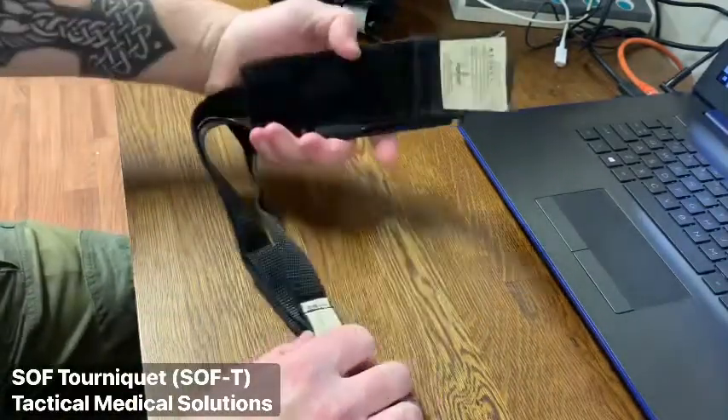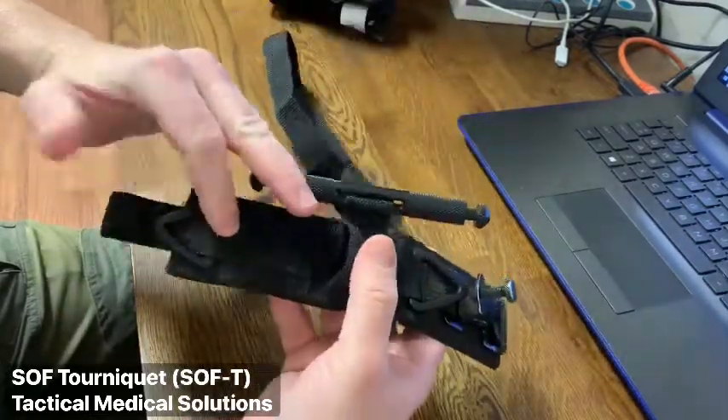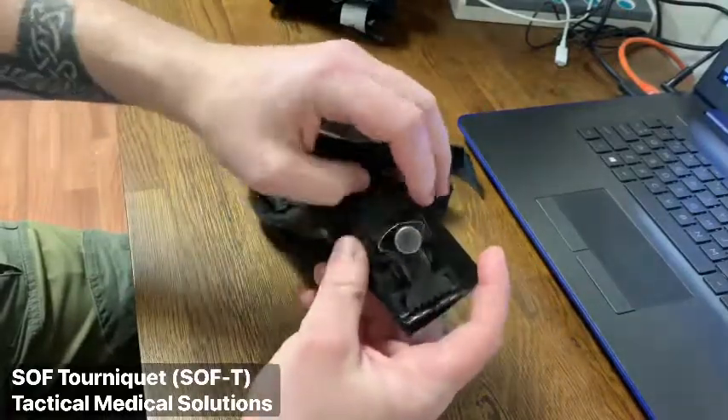Next, we have the SOF tourniquet provided by Tactical Medical Solutions. Again, this is an older generation from those currently available, so the function may differ slightly from the current generation.